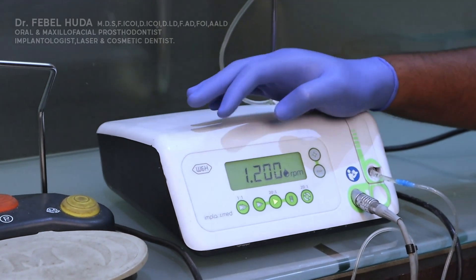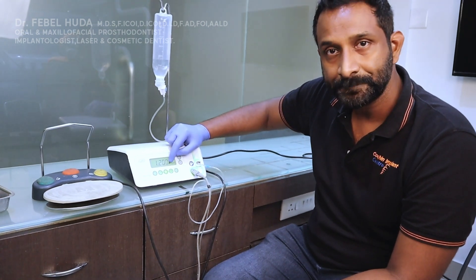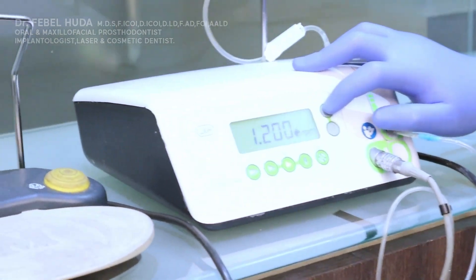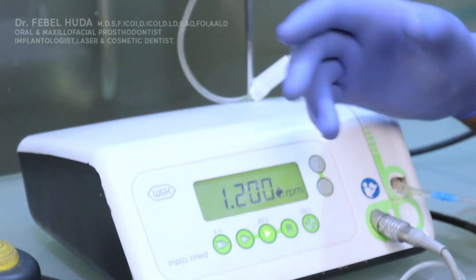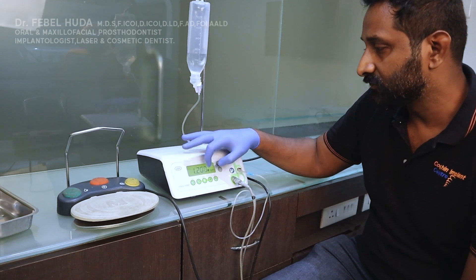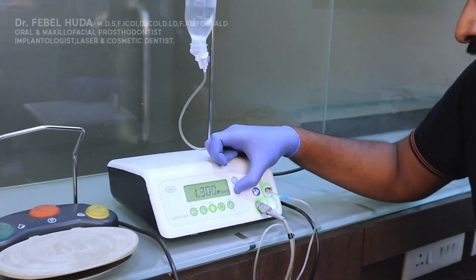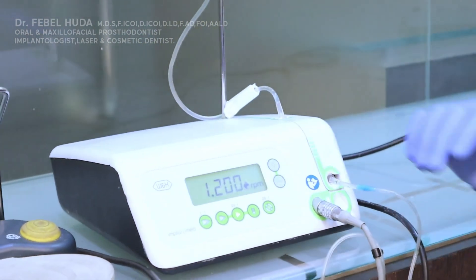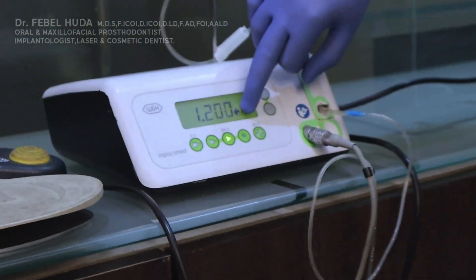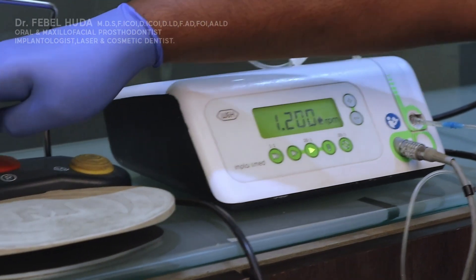In the 20:1 mode, the display shows two parameters: RPM and saline. The RPM can be altered with the up and down buttons. It will depend on where you're placing your implant, whether you're condensing graft or not — you control RPM up or down accordingly.